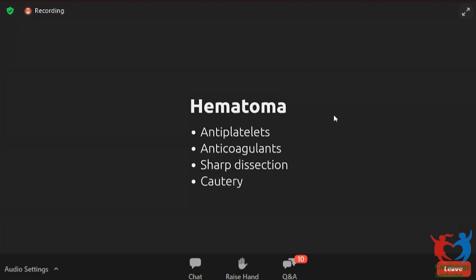For the cephalic vein approach, like I said, our incision is horizontal. Horizontal means it is not parallel to the clavicle; it is usually at a slight angle to the clavicle. We make it 2 finger breadths below the clavicle, which is better.